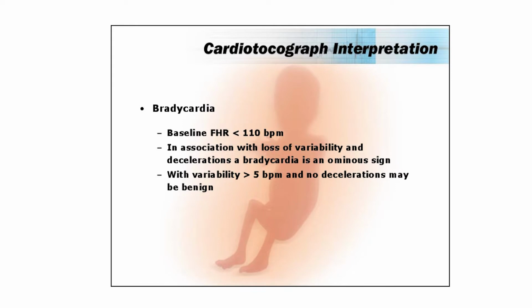And the midwives or obstetricians indeed have said, oh, it's a sleep type pattern, the baby's asleep. You only know the baby's been asleep if you have a normal tracing beforehand and a normal tracing afterwards. So you can't afford to wait much longer than the 40 minutes to make sure it's a sleep type pattern and not a hypoxic type pattern.